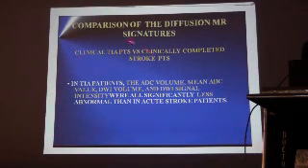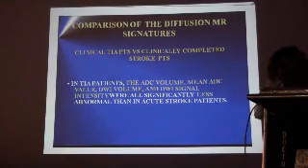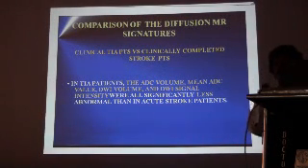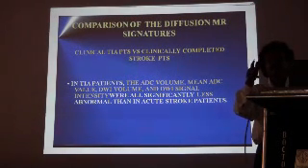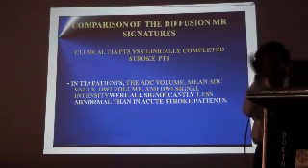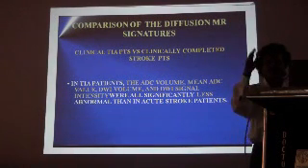Comparing clinical TIA patients versus clinically completed stroke patients, in TIA patients the ADC volume, mean ADC value, diffusion volume, there are so many parameters that are all significantly less abnormal than in acute stroke patients. We have to check. And actually, the point of the TIA definition is that a mini stroke should not be ignored. The patient will recover in 24 hours, but may progress to complete stroke in 50%.